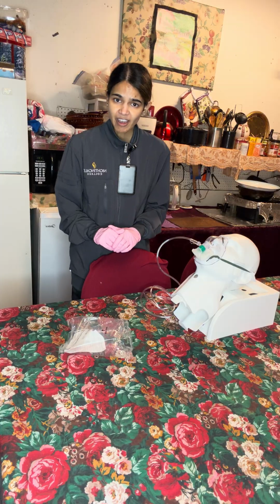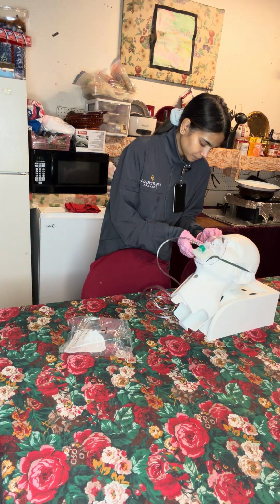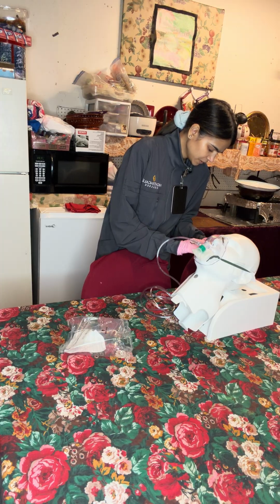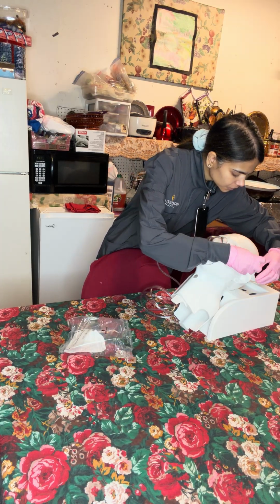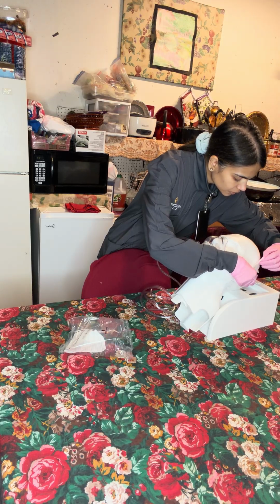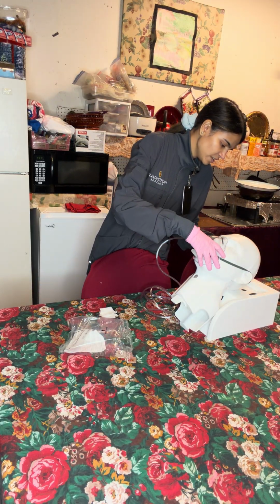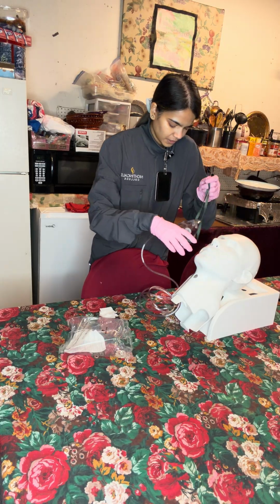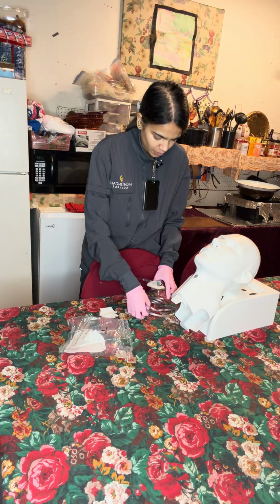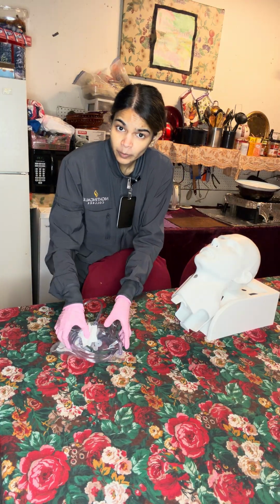I will begin now to remove the gauze and the mask. I'll remove the mask off the patient, and I will dispose of these supplies in an appropriate manner.